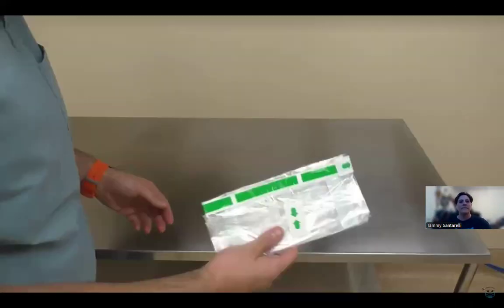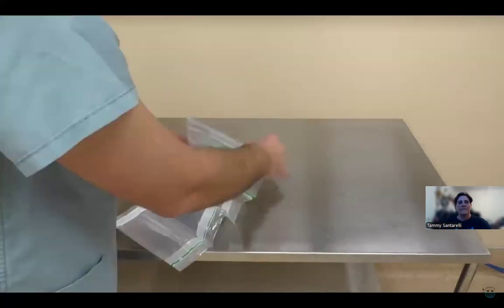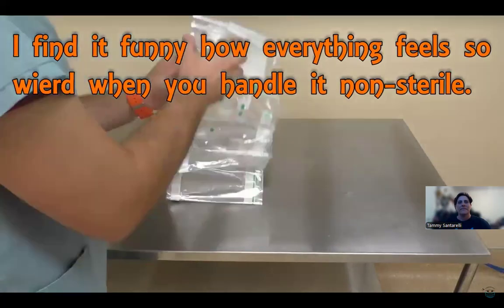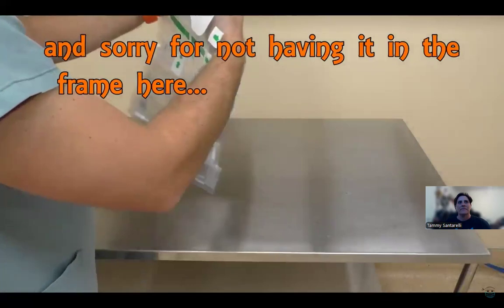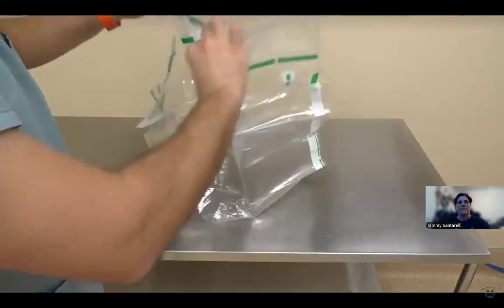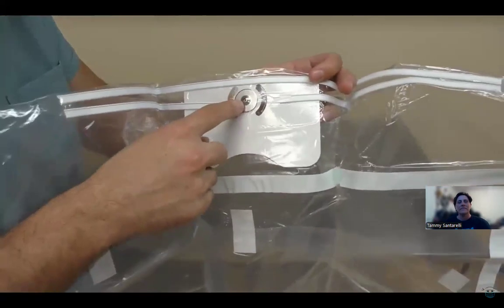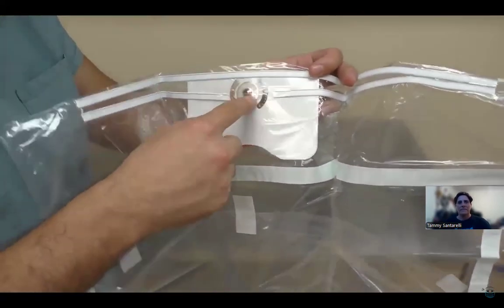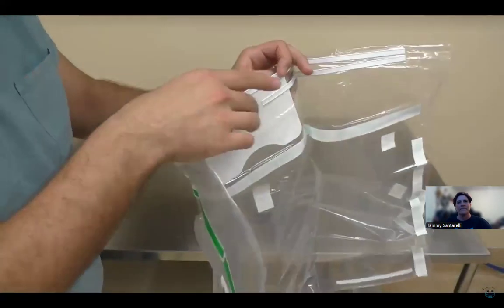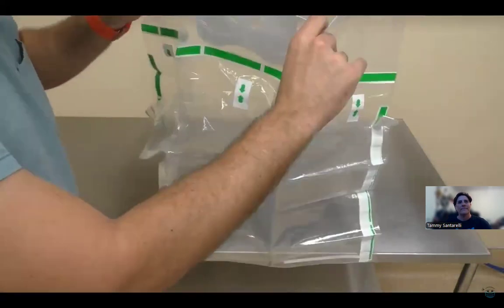Column drape when you get it on your table. We're just going to open it up. Just like that. And this is our magnet. This is the magnet that I was talking about that it's going to attach to on the column, or vice versa on the arms when we get the arm drapes. So you want to make sure that this is away from you. And I'm just going to place this right on the column.